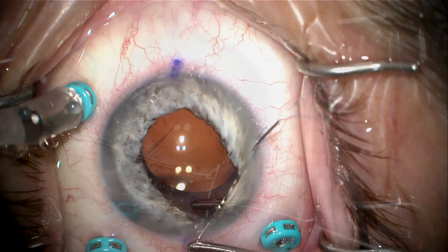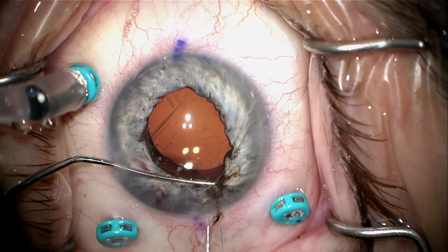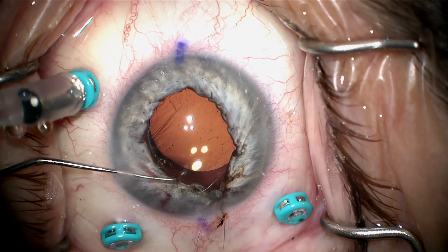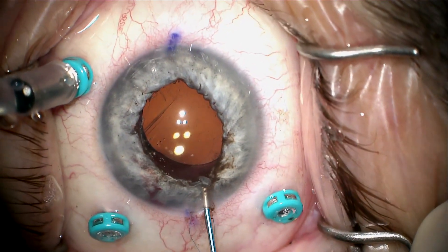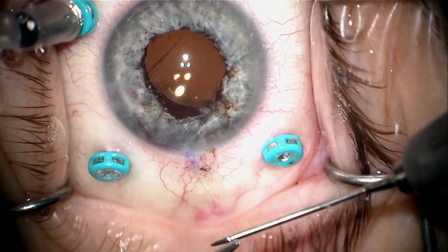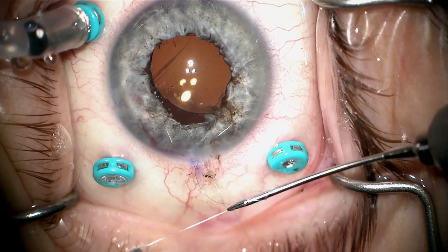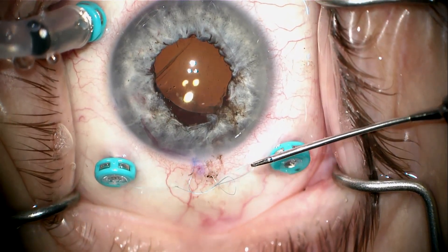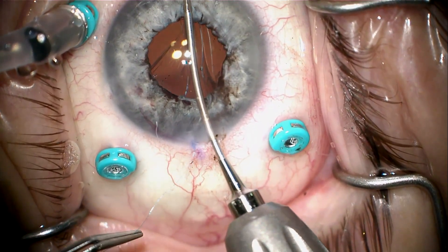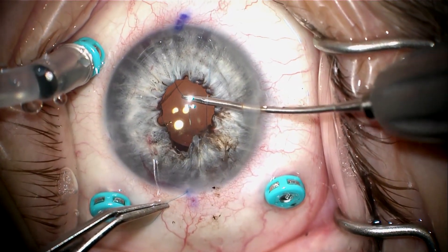Going clockwise on this side, we come out through the same paracentesis, holding the iris back. We've now completed a 360-degree suture pass. Now we just have to tie and adjust the tension. I'll inject a little viscoelastic to push the iris away from the incision, then do a three-throw, grab this end, and pull it down to the paracentesis so the knot is just outside the eye, then bring it in and tighten it with one side of the suture inside and one outside.